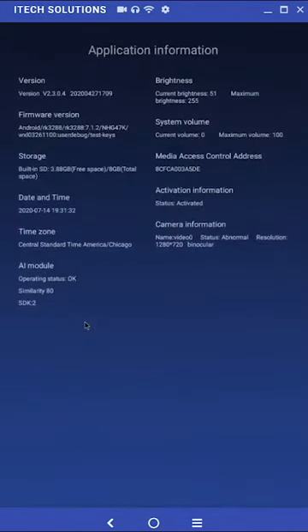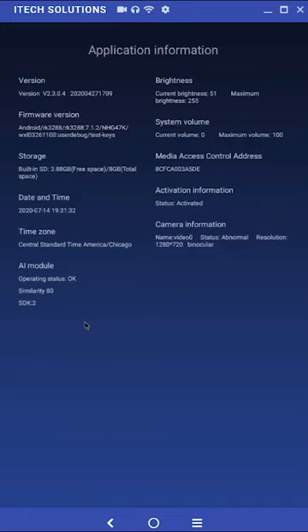Application information. Here you can find some useful information about your device, such as system firmware version, camera information, and the Mac address.